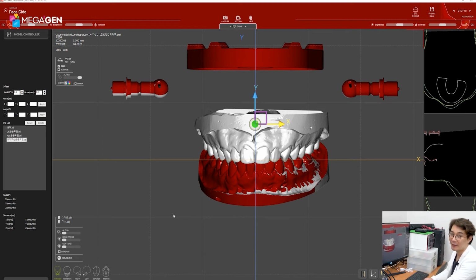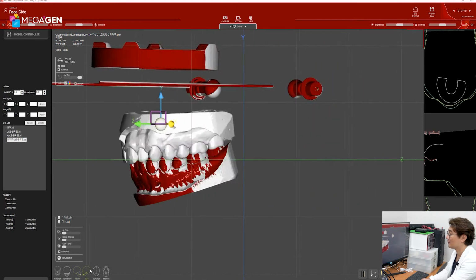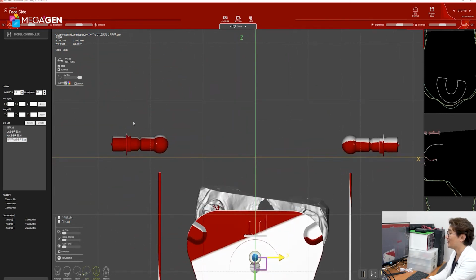Put in some appliance, like the anterior deprogrammer or CR stabilizing systems. Anyway, use three-dimensional technology. In the old era, you could not see the condyle position, but through digital technology, you can see the condyle position movement like this.